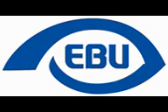And I believe it might be space with dots 1 and 3. I always think of it as space with the letter K for keyboard, to do keyboard help, if I'm not mistaken. Yeah. You may be right, yeah.